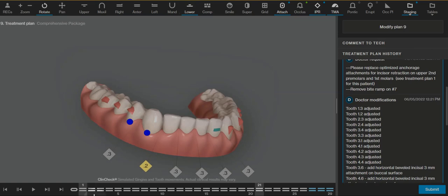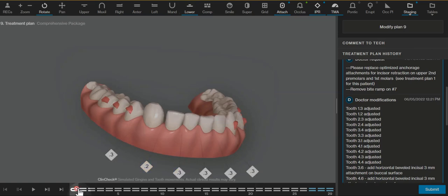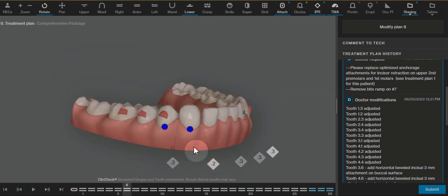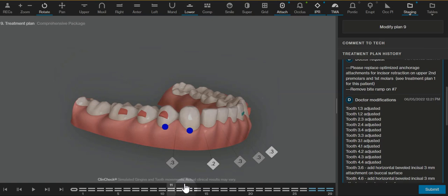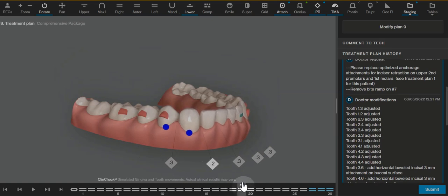The upper space is being closed. You can see these tooth movement assessment warnings and that's from a larger intrusion movement, which shouldn't scare us as long as we have plenty of posterior retention.